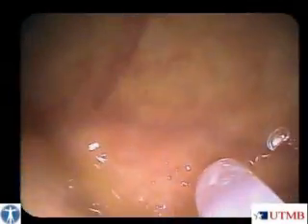Notice how this lesion is obscured by a colonic fold. Using a probe to move the colonic fold helps visualize the lesion better. The lesion is characterized by an irregular surface, the altered vascularity, and easy friability demonstrated with the probe. Notice the bleeding which occurs on probing the lesion. Instilling indigo carmine dye helps appreciate the mucosal abnormalities better.